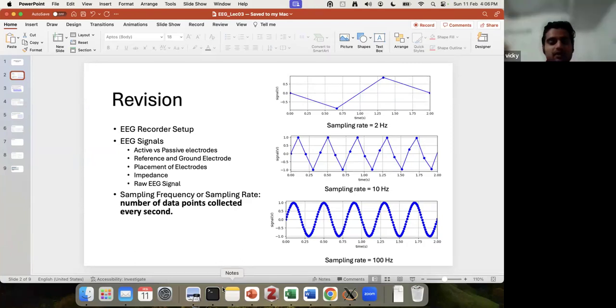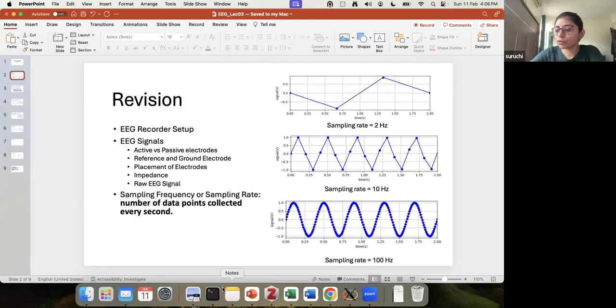So we discussed the impedance check. You were asking whether RNet is 1010 or 1020, right? I was checking the manual available on their website. It depends on the number of electrodes. If you have an RNet which has 128 or more, that is likely to be 1010. If it's 32, it is likely to be 1020. For 64, you should check. It should still be 1020 in my opinion. If you have more electrodes, then you go to 1010 because you need more space.